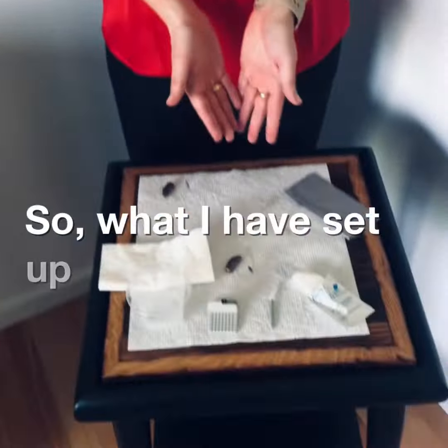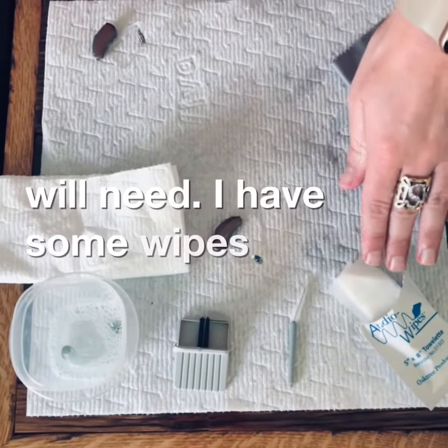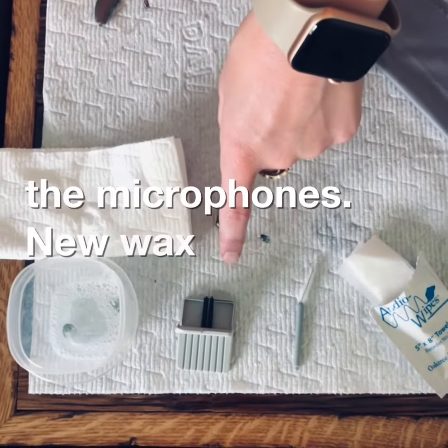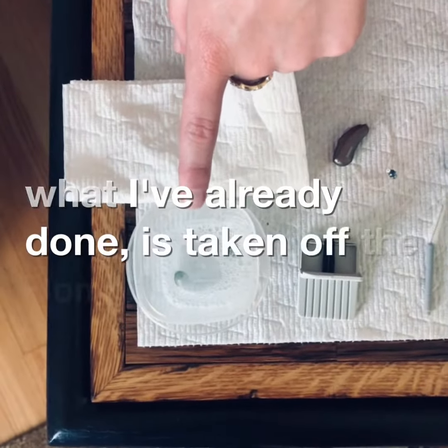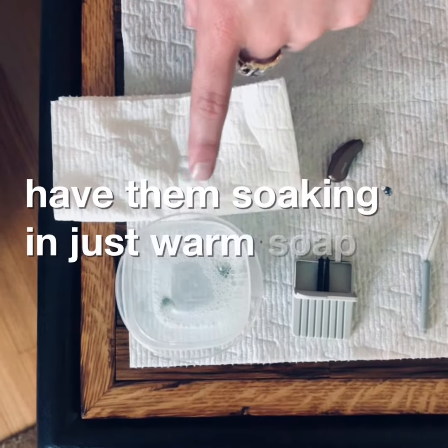What I have set up here is just some materials that you will need. I have some wipes to wipe off your hearing aid, a brush to brush off the microphones, new wax traps if the wax trap needs to be changed, and I've already taken off the domes of the hearing aids and have them soaking in warm soap and water.